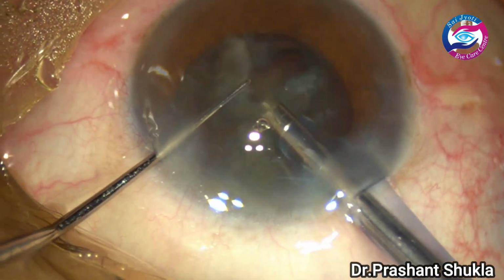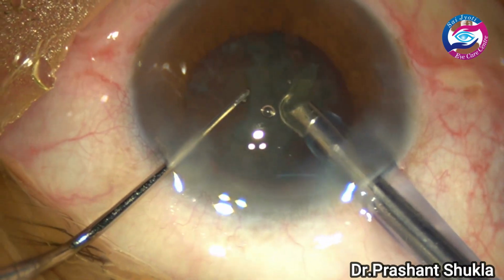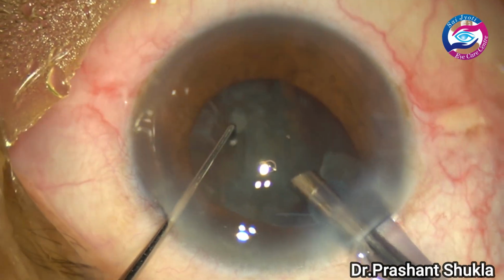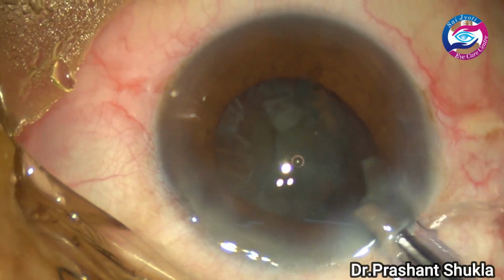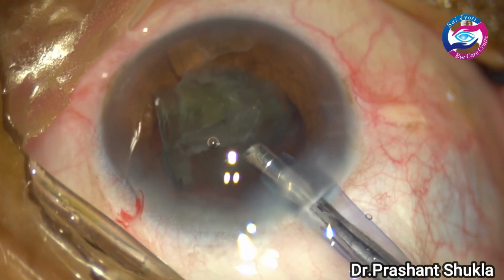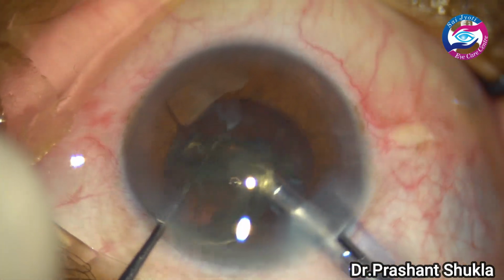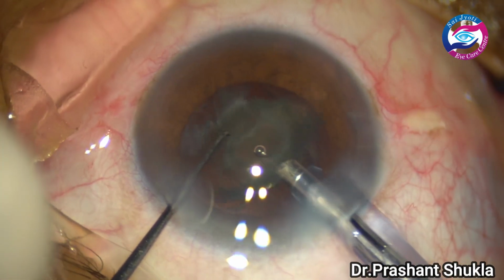The pupil size is also small, so I feel I am doing the emulsification at a relatively anterior plane. Now one heminucleus is left and I feel it is time to put in some viscoelastic just to protect the corneal endothelium. So I am going to come out and replenish the viscoelastic. Now I have taken a small blunt Sinskey and the last bit of nuclear fragments are being emulsified with very little phaco power, 25, and vacuum 250.